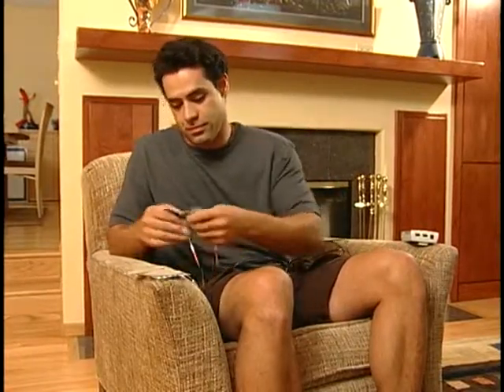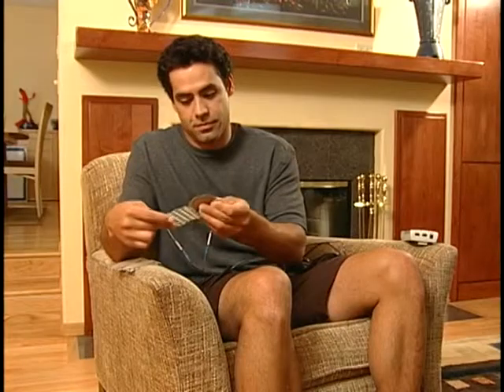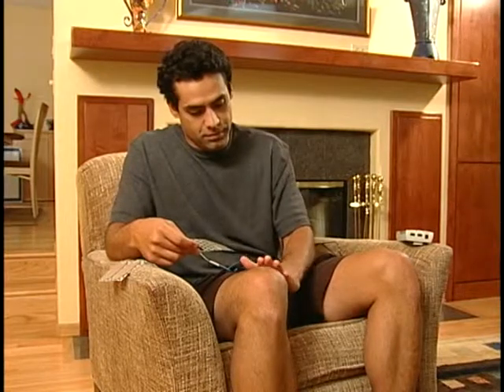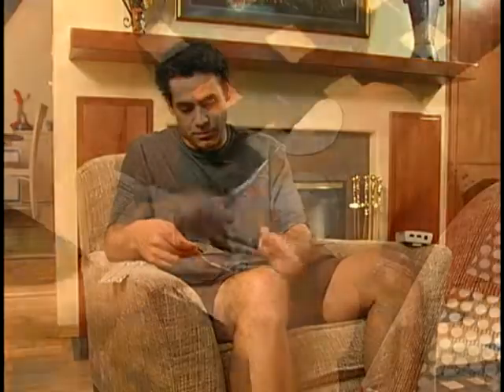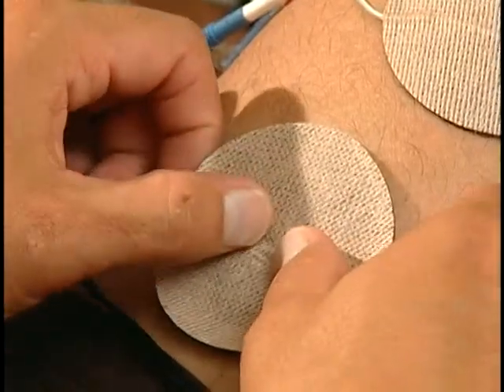Find a comfortable place to sit for any leg or arm treatments. Next, slowly remove one pad at a time from its plastic sheet. Do not pull on the tail of the pad. Place each pad on your skin according to your prescription. Press down firmly on each pad so it sticks.